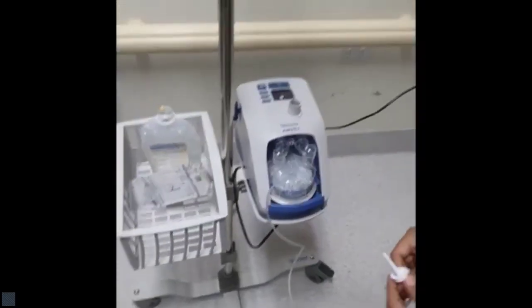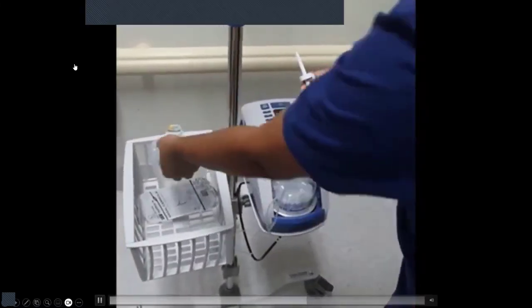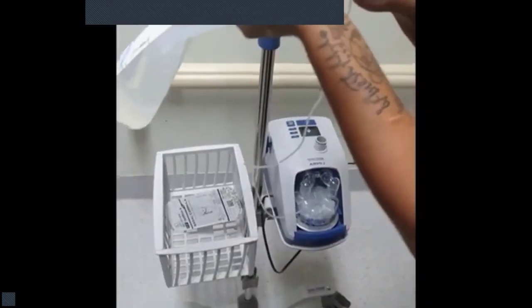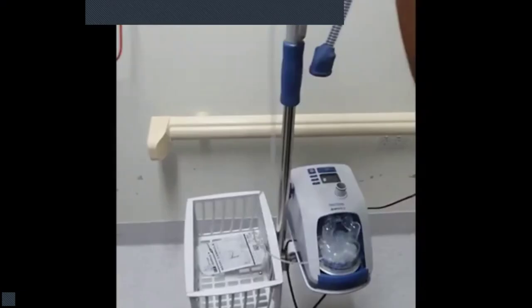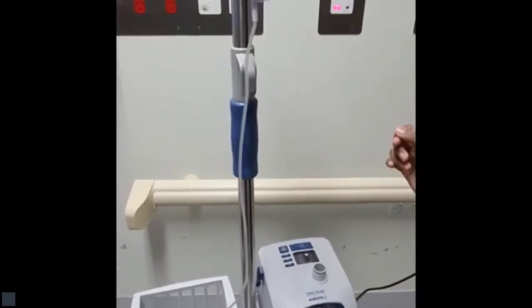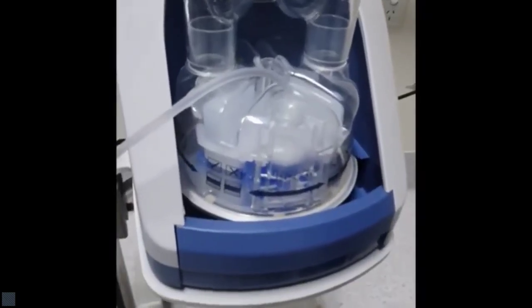So once that's done, we'll attach the water supply tube spike into the bag of our sterile water. Cap on the side of the bag spike. And then we'll ensure that the bag of sterile water is 20 centimeters above the humidifier.